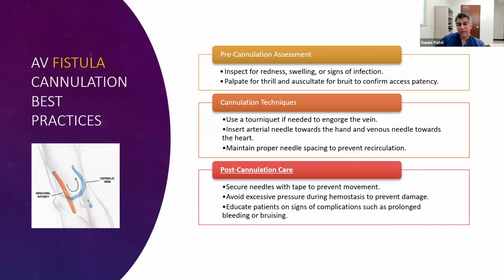And then you want to teach the patients about signs of bleeding, signs of complications. You want to get them engaged in their own care, because when they're not in your dialysis unit and they're out and about in the world, they're living with that access. Teaching them when things look troublesome, if they have bleeding, what to do and how to take care of it, empowers the patients and helps with the overall care.